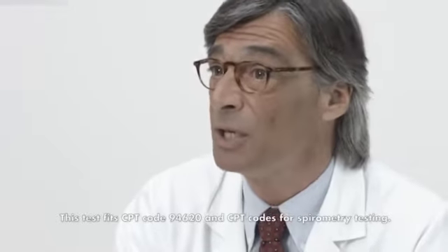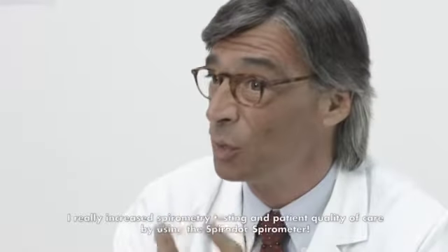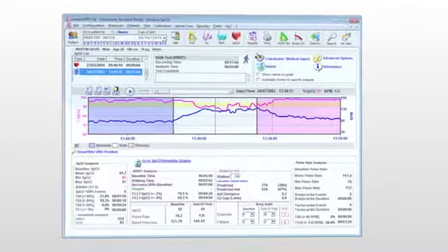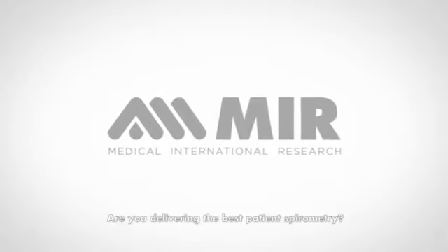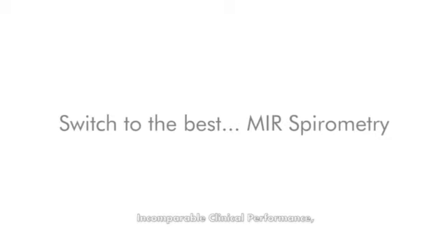This test fits CPT code 94620 and CPT codes for spirometry testing. I really increased spirometry testing and patient quality of care by using the SpiroDoc spirometer. Are you delivering the best patient spirometry? Probably not. Switch to the best — MIR Spirometry. Incomparable clinical performance.